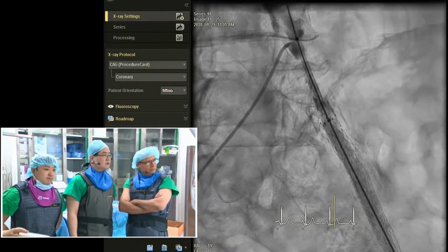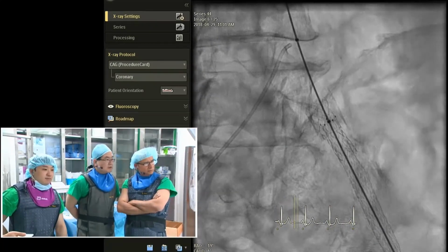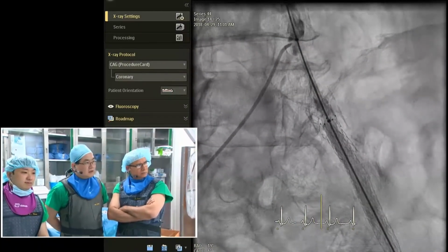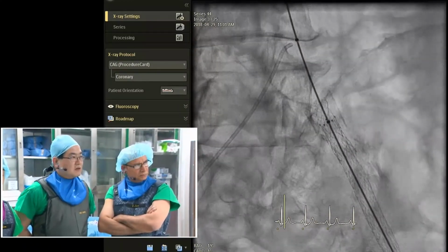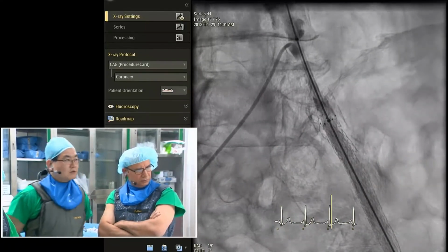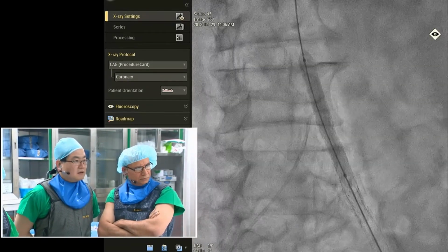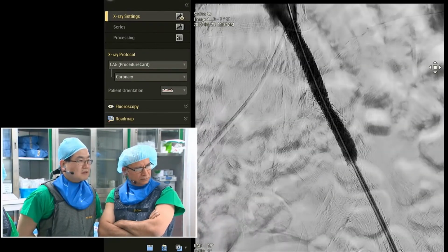After the balloon and angio, so okay. After the self-expanding stent, we measured the 40 millimeter balloon for the exact site of the Life Stream stent graft, the proximal portion of the left common iliac ostium. So we have a landmark for the lower portion of the vertebra. So we put the 9 by 59 millimeter Life Stream stent, and balloons. And after that, we checked the angiogram for the right side and left side.